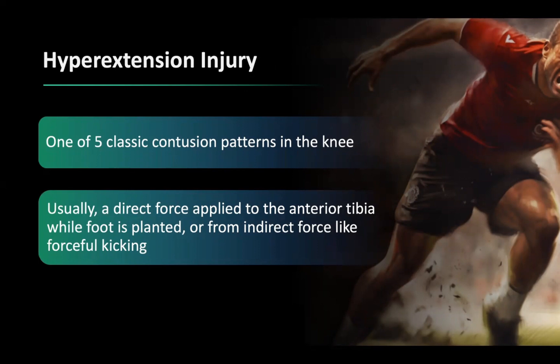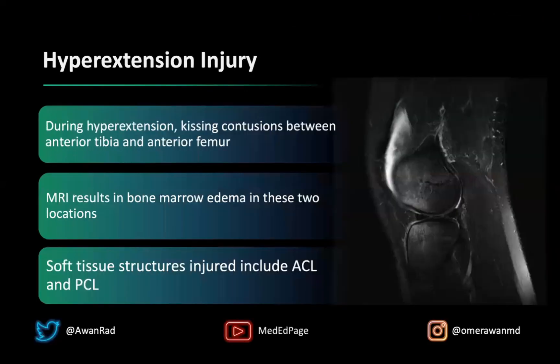In the case of a hyperextension injury, you typically get a direct force applied to the proximal tibia. This can occur from sports injuries like soccer from forceful kicking. You'll typically get kissing contusions between the anterior tibia and the anterior femur. Notice there's no discrete hypointense fracture line — these are bone bruises, microtrabecular contusions, kind of like fractures without a fracture line.